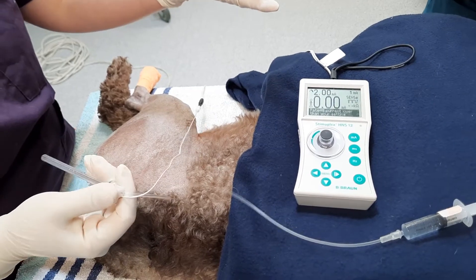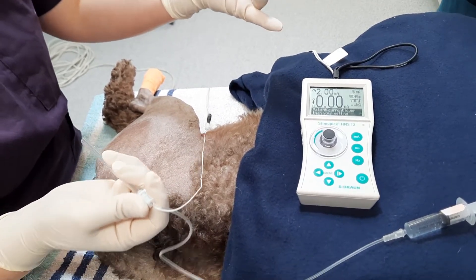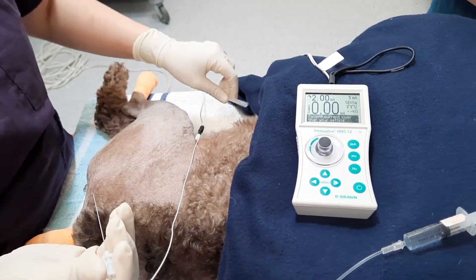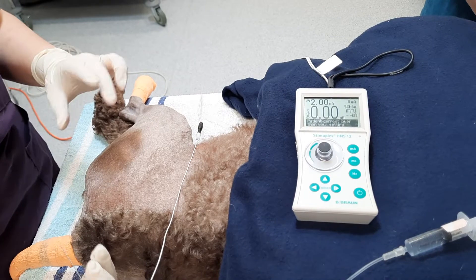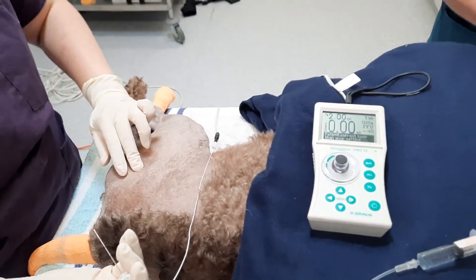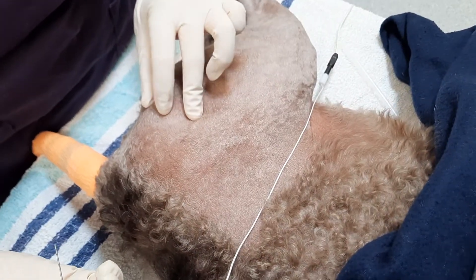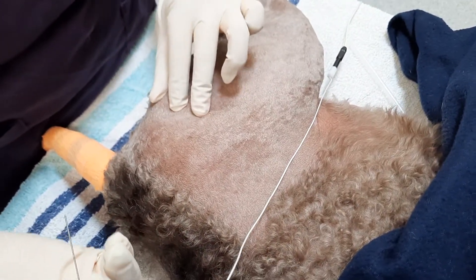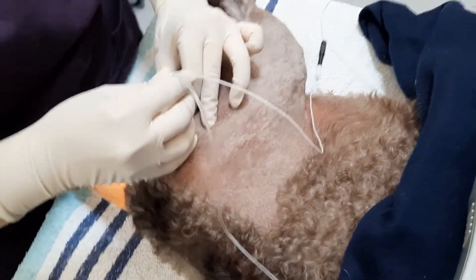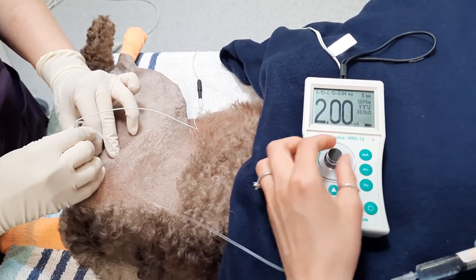Here you'll see that we have the nerve stimulator. We start with a 2.00 mA voltage. For the sciatic nerve block, we are first palpating the greater trochanter and also the ischial tuberosity. Midway between these two landmarks is where we'll insert the needle, perpendicular to the site.